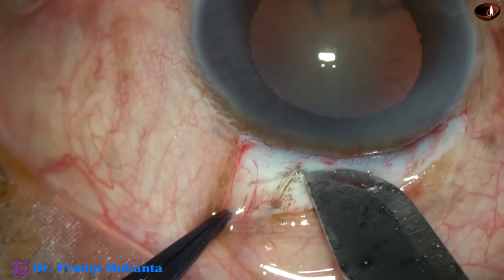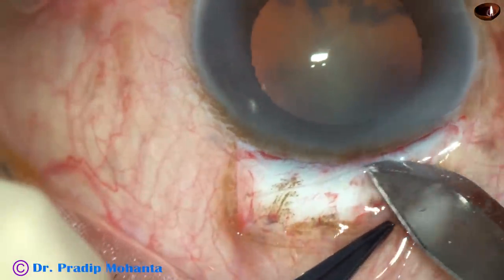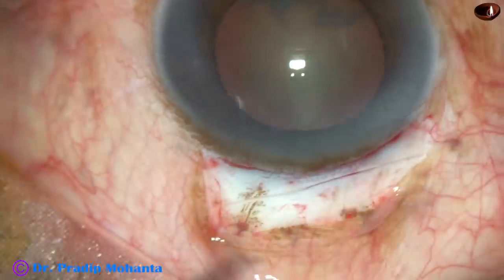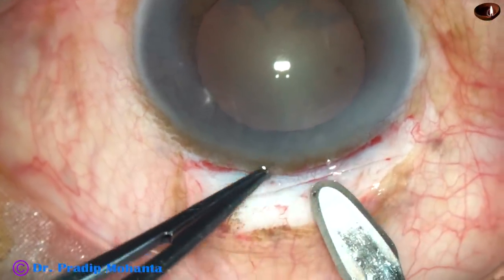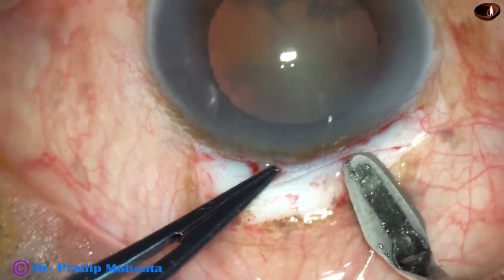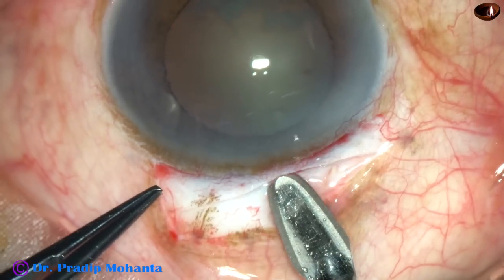Now place the incision — almost a straight incision. Don't make it very small; make it about 7.5 mm. In hard cataracts, about 8 mm.